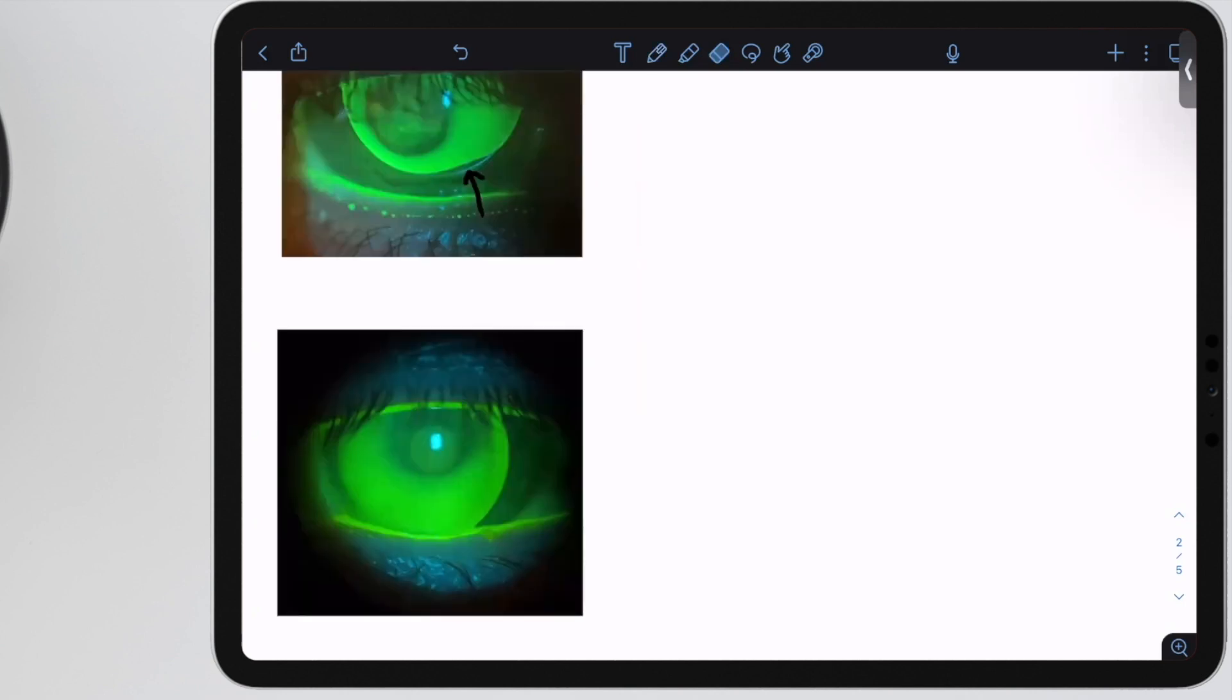Here's a less extreme example, but you can still see this area of central bearing where you can see the pupil and iris details through the lens, versus in the mid-periphery where you're getting a lot of fluorescein pooling.